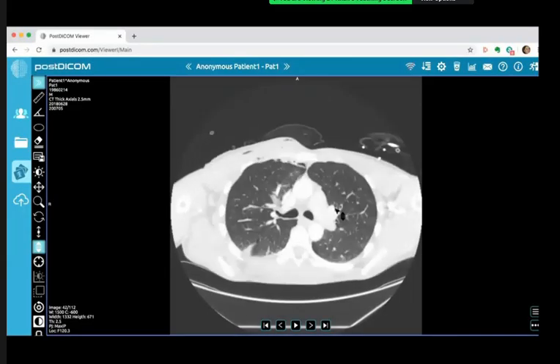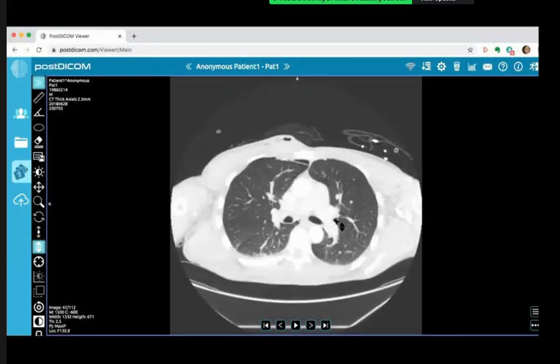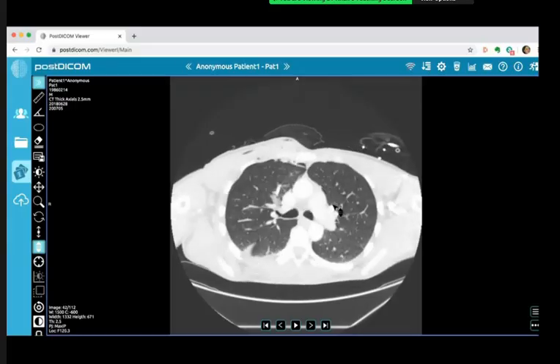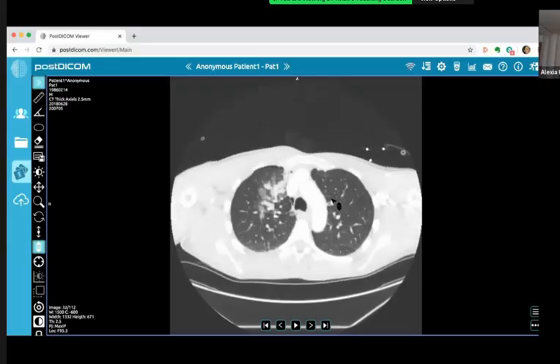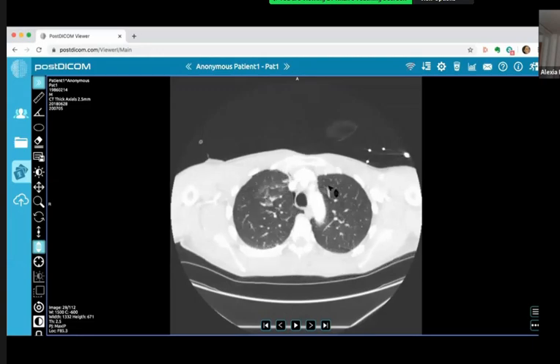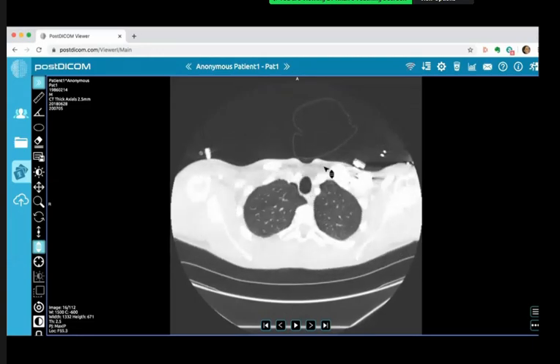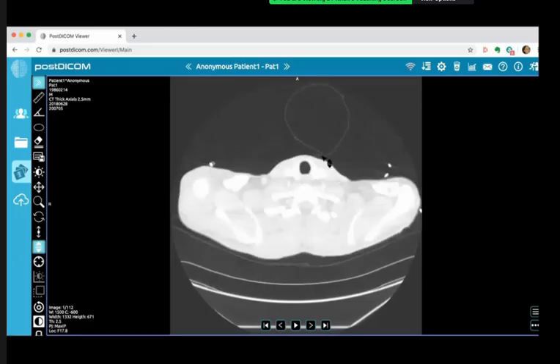However, this is a major injury, and I'd be suspicious of any injury to the hilar as well. So I would advise the clinical team of my findings. I'd also like to ask the team how the patient is doing. Is he stable or not at the moment?